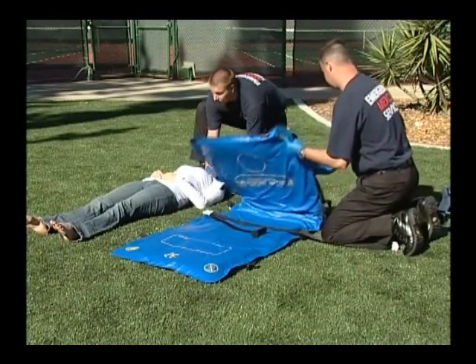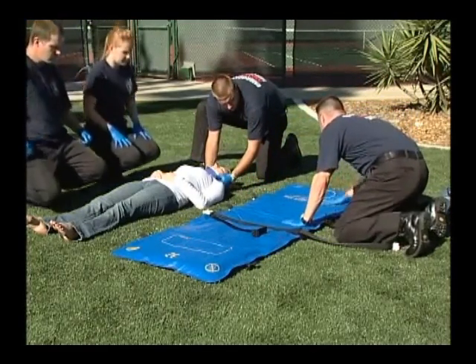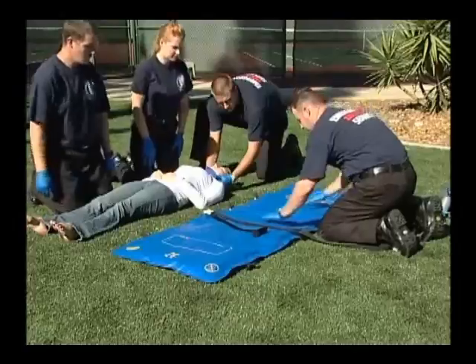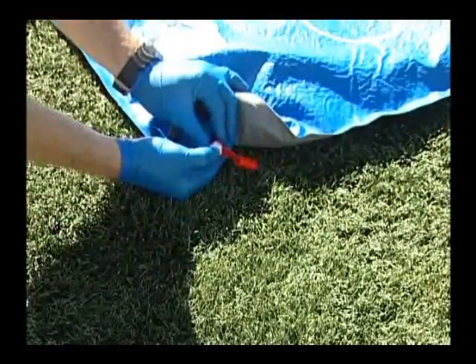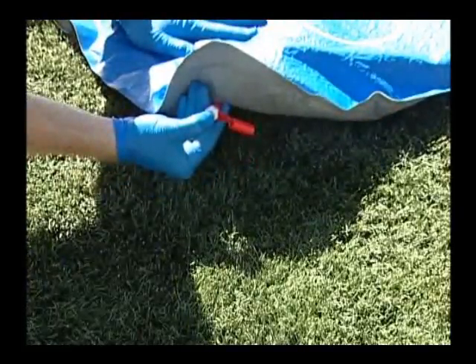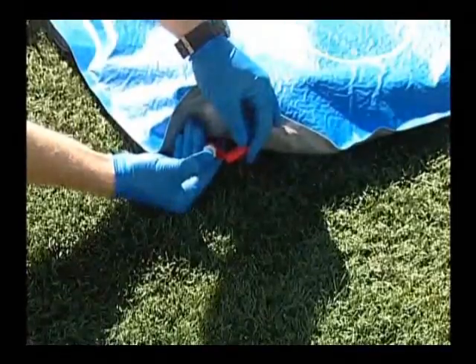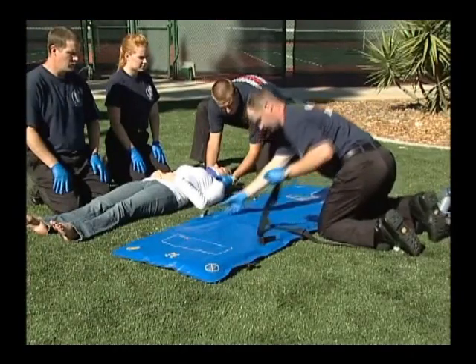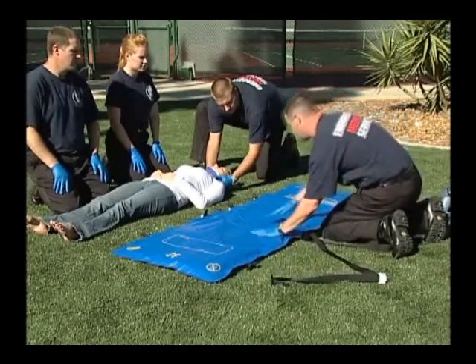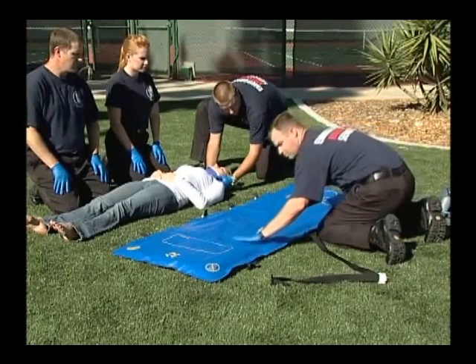Lay the evacuosplint mattress out on a flat surface near the patient. The head and shoulders logo indicates the head end of the mattress. Remove the red vinyl leashed cap from the valve. Release any vacuum in the mattress by pushing in the red valve stem. Keep the valve stem pushed in until the mattress is pliable. Disconnect the patient restraint strap from the mattress, or if desired, disconnect a strap only from the side of the mattress nearest the patient.